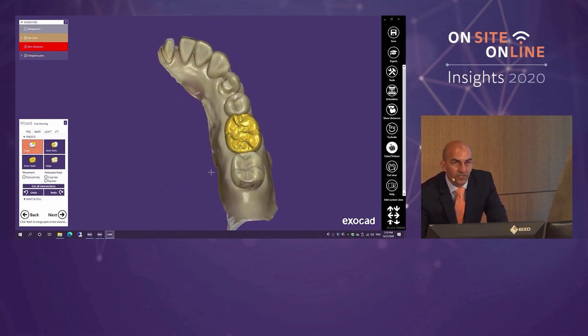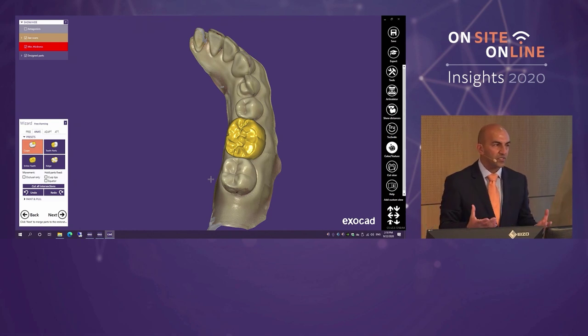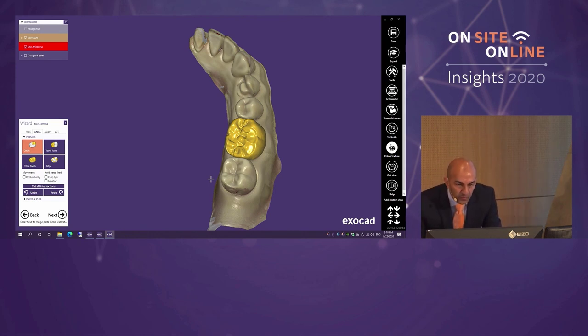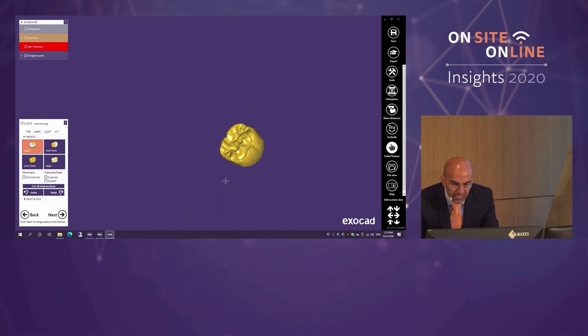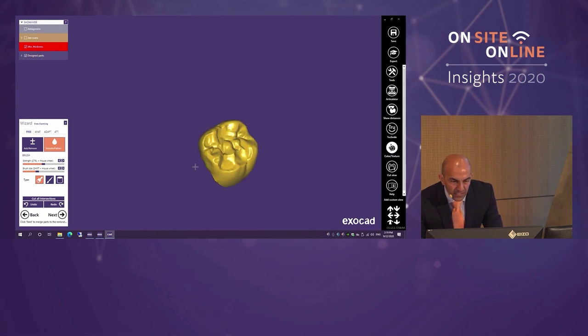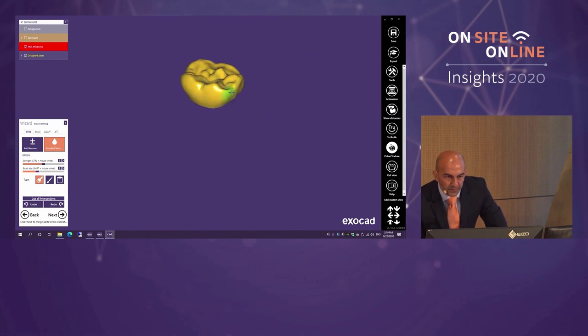The fastest possible workflow is: do your macro movements first — your big changes — then fine-tuning, and then you're ready to mill. We'll be milling in under five minutes. Pressing S on the screen hides the scan data. My favorite tool in free-forming is Smooth. I use the left mouse button to trace around the tooth, rotating with the right button. In clinical practice I use both hands — a space mouse on my left and the regular mouse on my right.